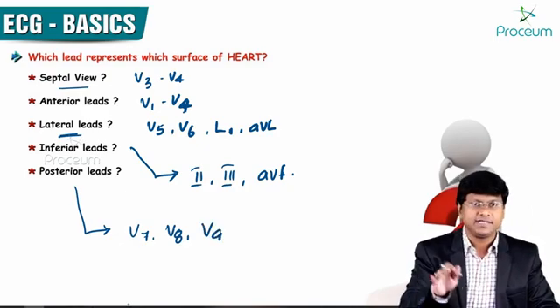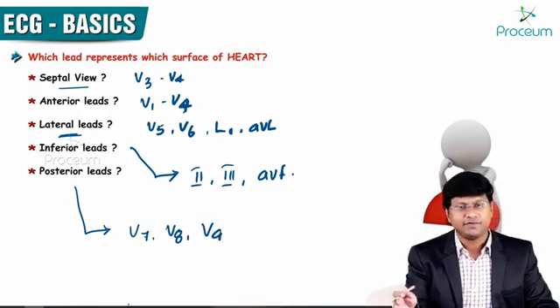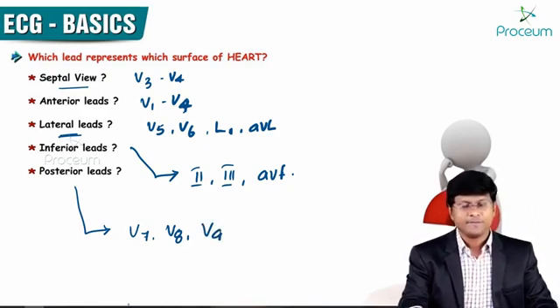Actually, we don't add any 3 more leads to V1, V2, V3, V4, V5, V6. What we do is just replace them.